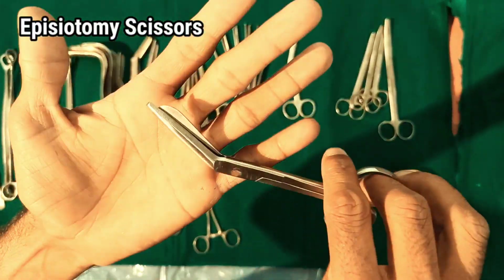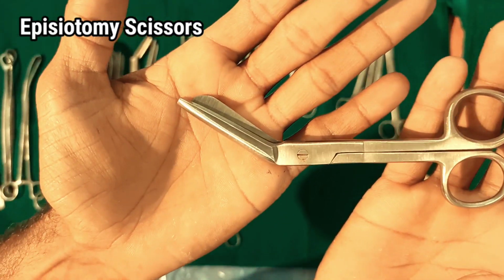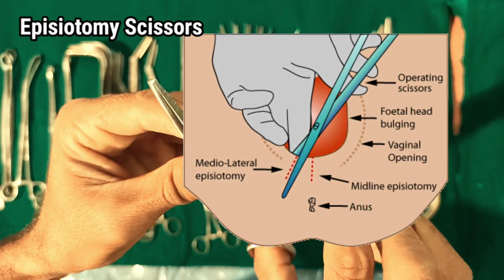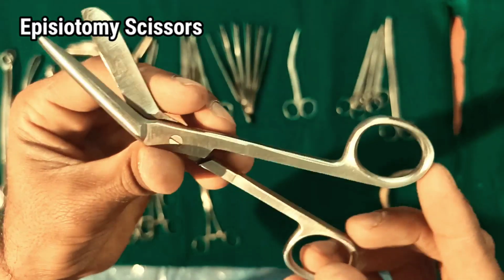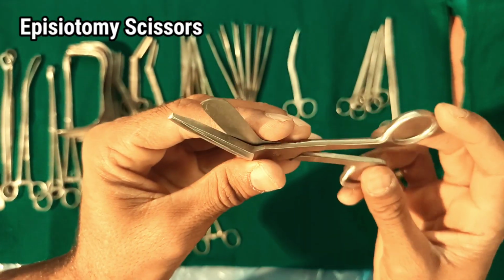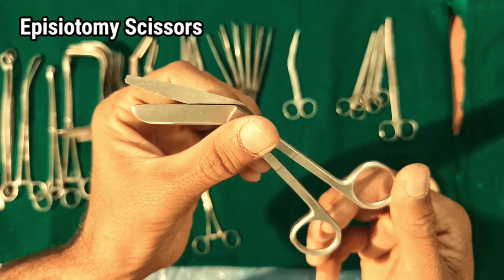Episiotomy scissors. Episiotomy scissors are angled scissors. An incision is made using episiotomy scissors to the perineum, the muscles between the vagina and rectum, to widen the vaginal canal for delivery. The sterilization process kills any type of germs and bacteria and makes this safe for use.